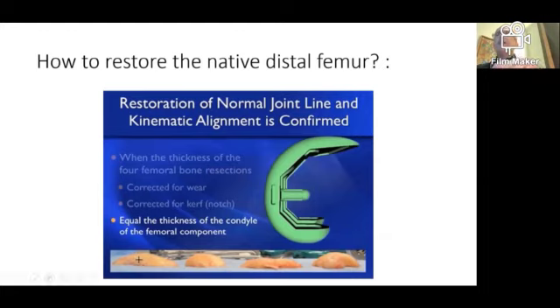You have from anterior to posterior the different fragments. This is the anterior here, this one is here, this one is here, and this one is the posterior. You should have almost the same thickness here as here, the same thickness here as here. Then you need a caliper to see how much the thickness is, and you take into consideration the thickness of the saw, which is almost 1 to 1.5 millimeters that you have to cut.